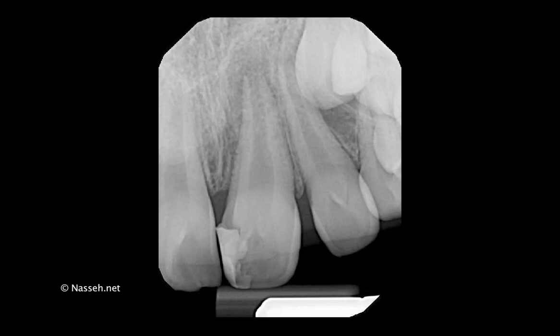Hello and welcome to another Mycosurgical Endotutorial. My name is Dr. Alan Ali Nassir and I'd like to share with you another tutorial in the use of bioceramics. In this particular case, for one-step apexification. We have a nine-year-old patient with tooth number nine being devitalized.